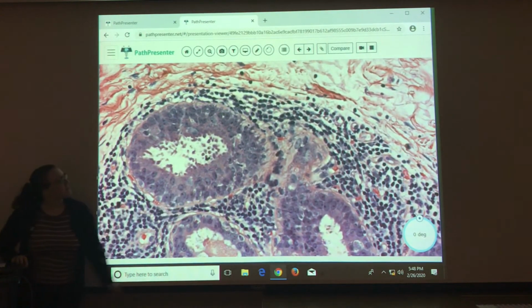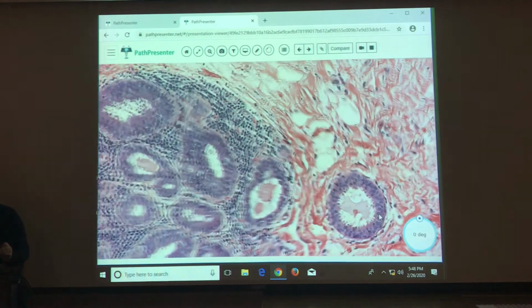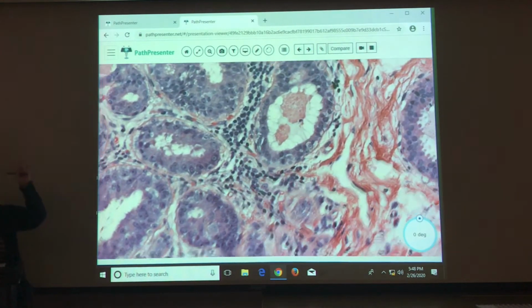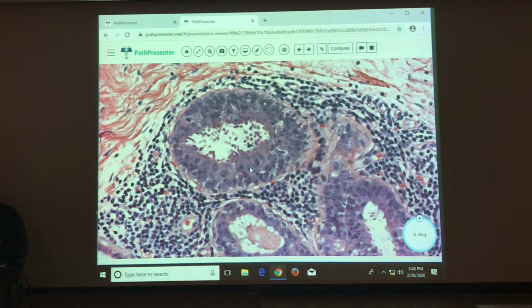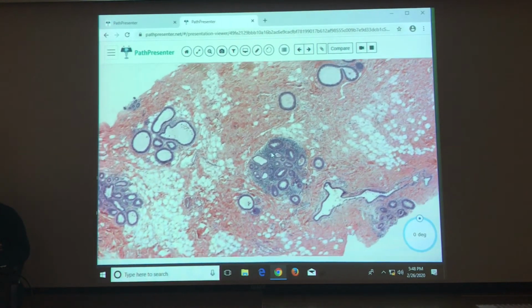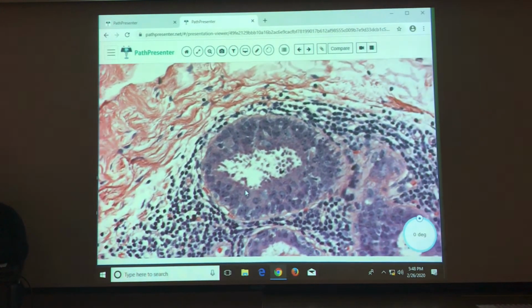I think FEA is in this spectrum where some people want to call a lot, but when you're looking at it, is it FEA, or are we maybe going into some ADH, but we don't have enough yet? So everything's in this spectrum.